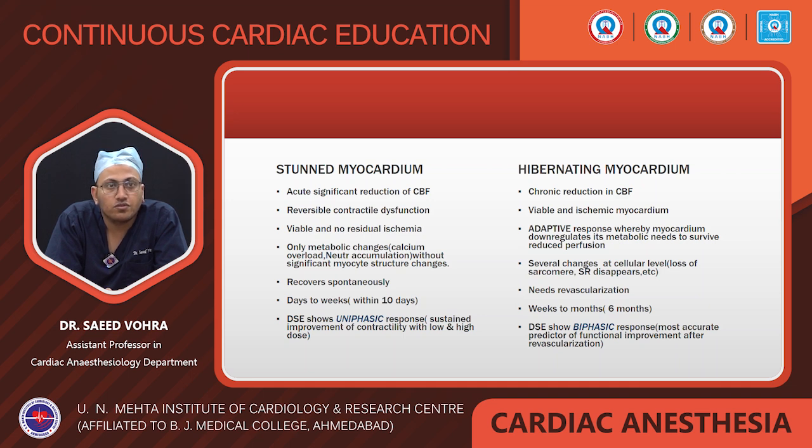Stunned myocardium shows a uniphasic response to dobutamine stress echo, that is, a sustained improvement in contractility occurs with low dose, and at higher doses contractility increases further. It becomes more hypercontractile. Whereas in hibernating myocardium, at a low dose of dobutamine there is increased contractility, which worsens at a higher dose of dobutamine.